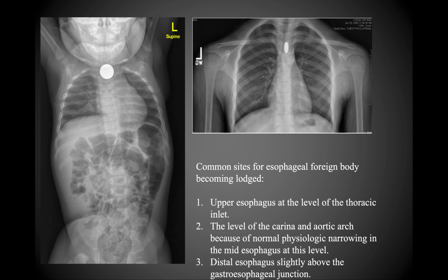oftentimes it is. And so in terms of the common sites where a foreign body might become lodged in the esophagus, we have the upper esophagus at the level of the thoracic inlet.